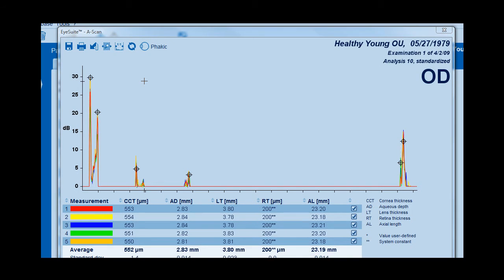To manually adjust the lens gates along the A-scan, it is strongly suggested that the user magnify the area intended for manual adjustment. To magnify, simply click on the magnifying glass icon. This will give the mouse cursor the appearance of horizontal arrows pointing left and right. Then left click and hold to highlight the area to be magnified. Letting go of the mouse button will enlarge the highlighted area.